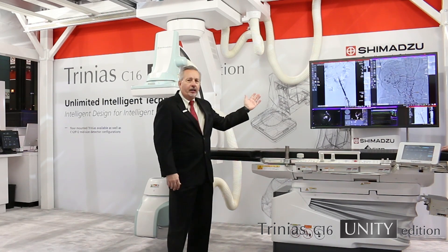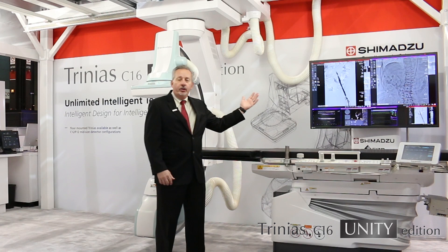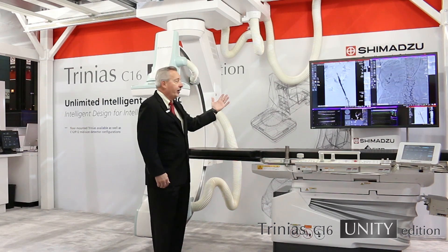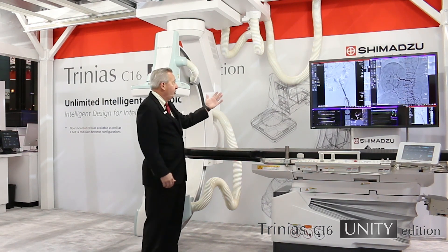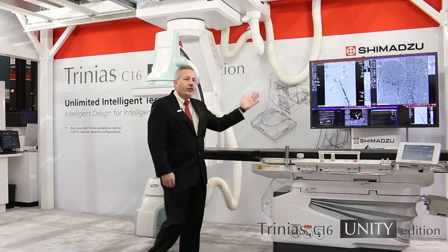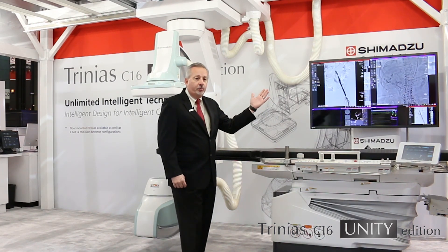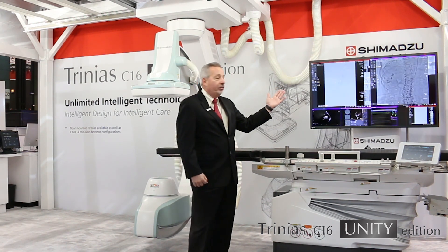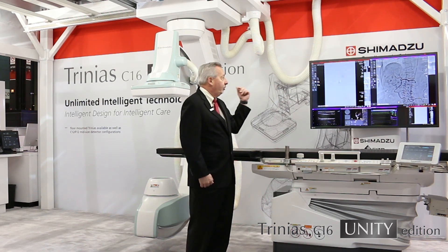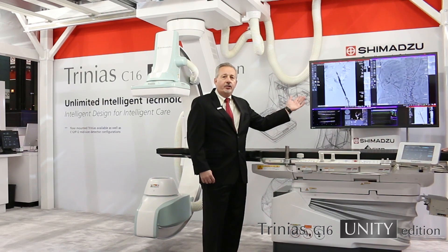The Smart Display gives you the ability to lay out the image monitor however you would like to. You see here six images up on the display, with two large images. On the left-hand side would normally be your live image — you see it replaying the DSA study. On the right-hand side shows our unique SCORE RSM feature. RSM DSA is proprietary and patented by Shimadzu and gives us the ability to move using our precessional mode — you can actually move while you're doing RSM DSA and get some unique imaging.